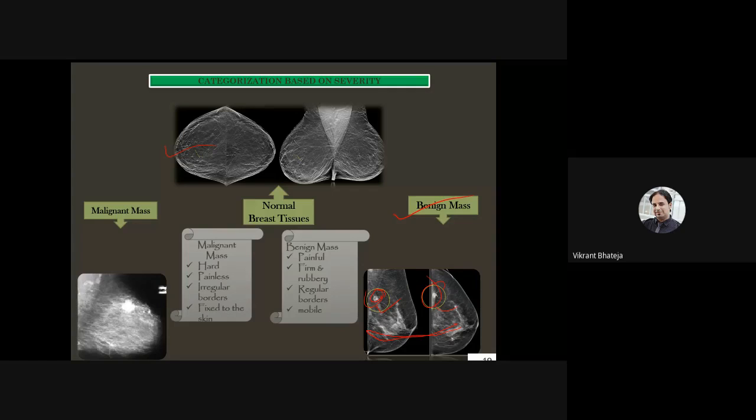Now, coming to malignancy, as I told you, once the edges of the tumor region start getting stretched out and distorted, like radiating lines from a sun or something like an object, this particular stage is indicative of malignancy, and you say that it is a malignant mass.